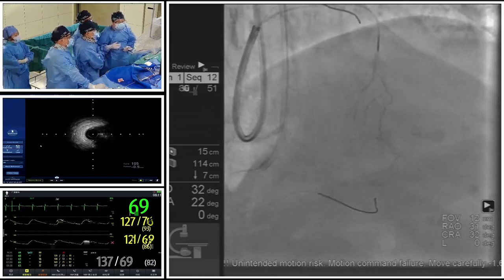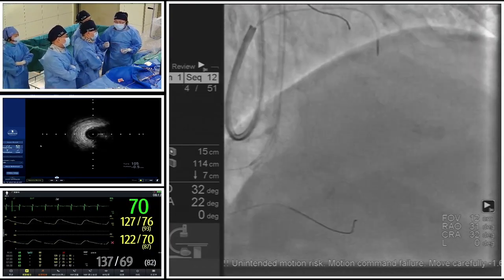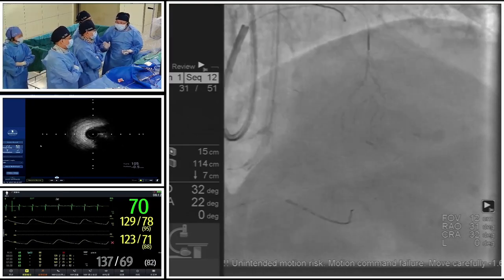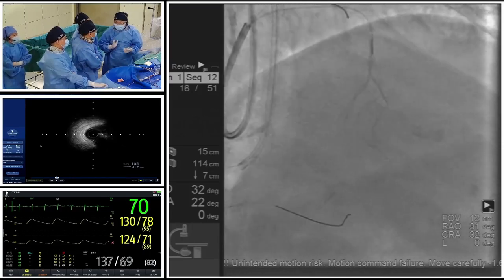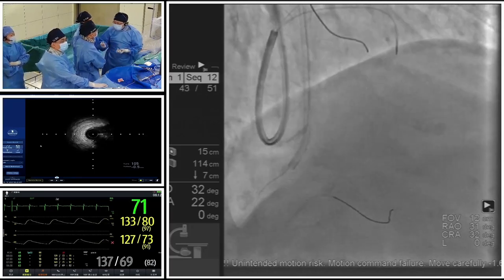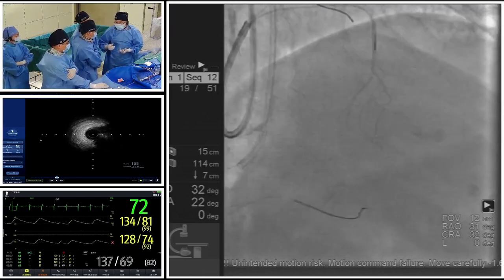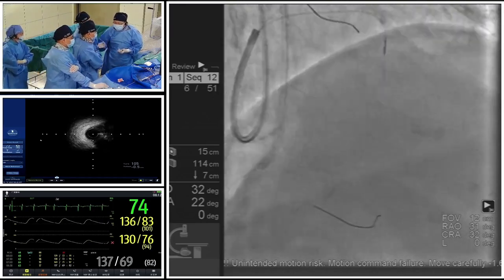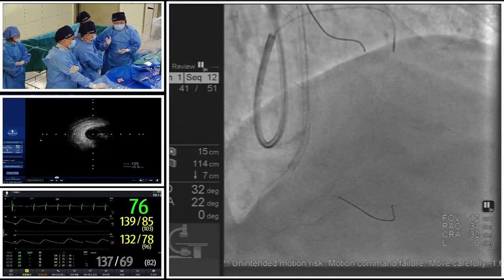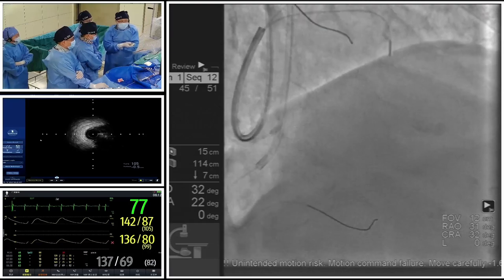So then we tried the septal collateral channel, the first septal collateral channel. As we know, for a very proximal septal collateral channel, sometimes we use wire surfing to connect to the RCA posterior lateral branch. Just now I already said the posterior lateral collateral channel should be the optimal route for the retrograde wire to puncture the distal cap.